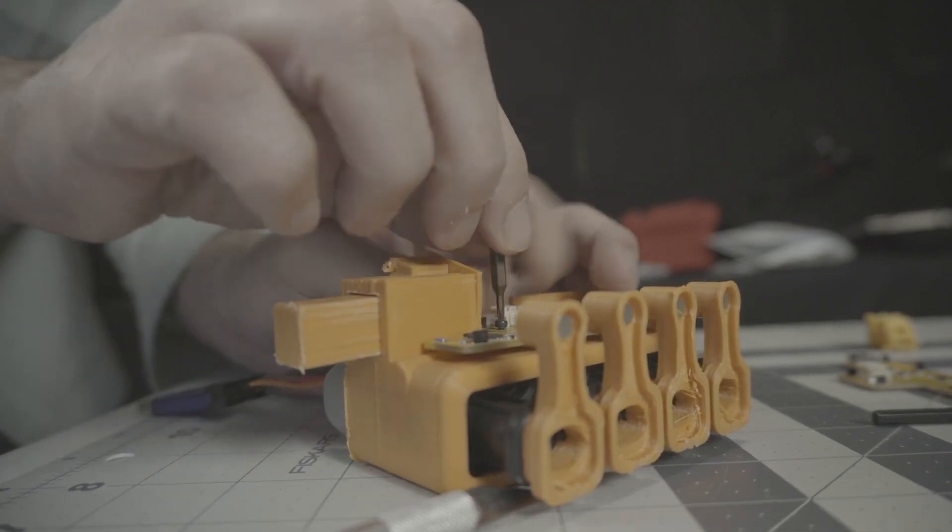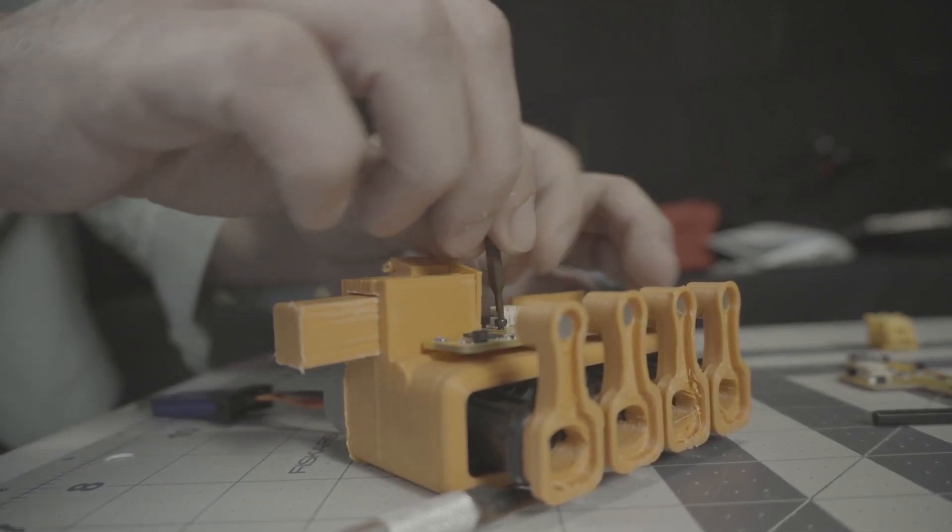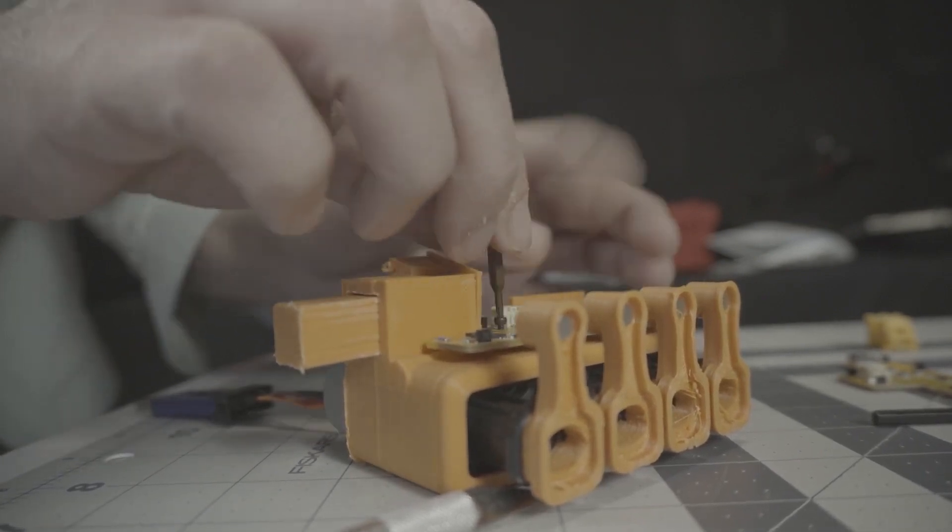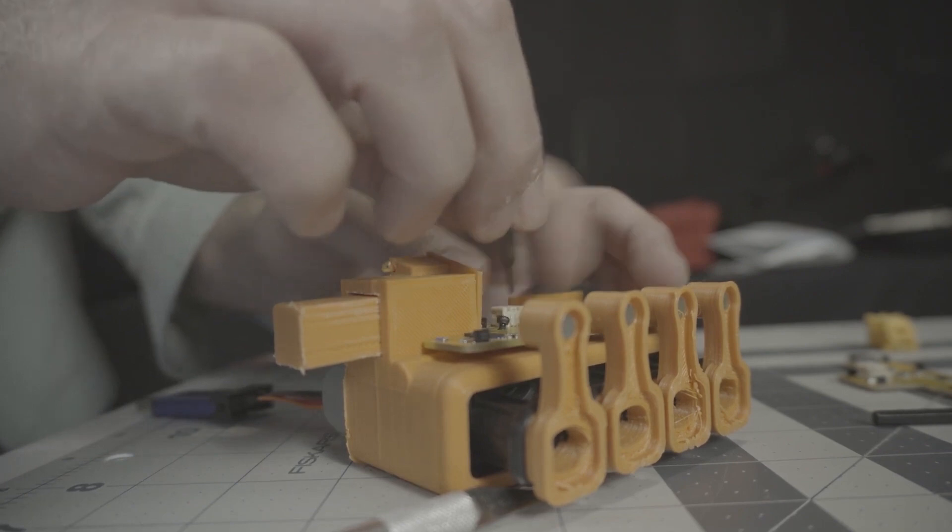First I need to remove the screws on the custom case that we made for everything. It is just a temporary case at the moment.